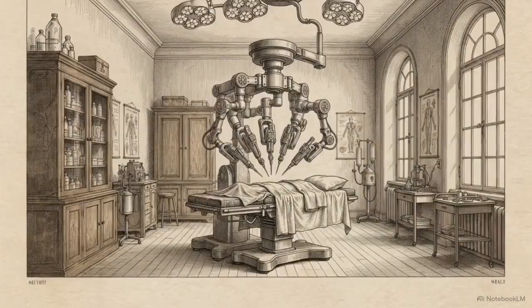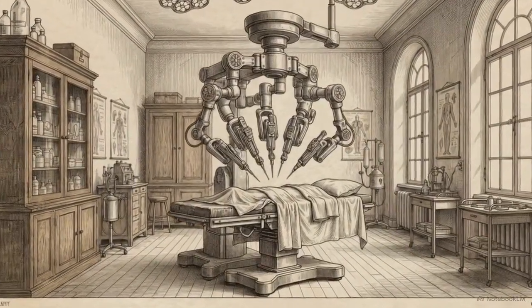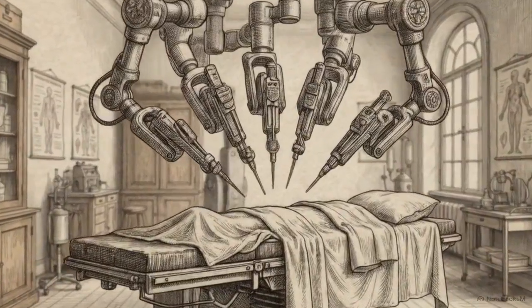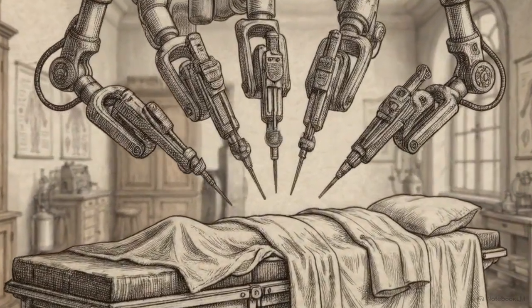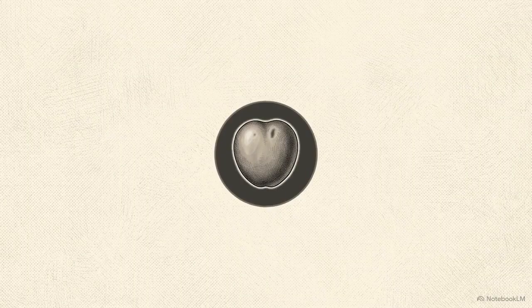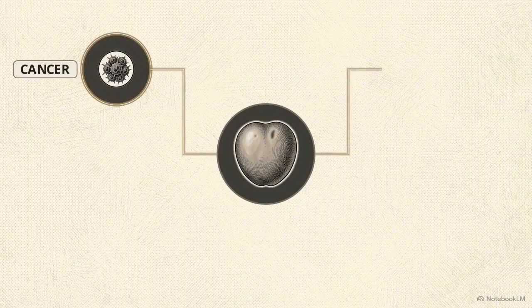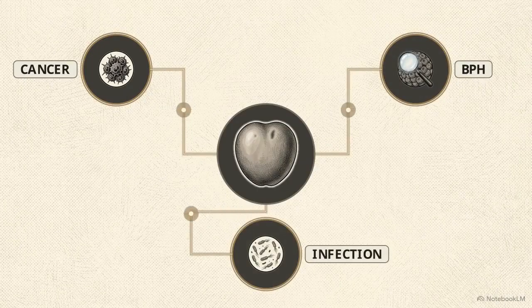Every measurement, margin, and zonal assignment on a scan dictates where a surgeon places a scalpel, fires a laser, or spares a nerve. Ultimately, matching the anatomical lexicon to the specific disease, cancer, BPH, or infection, transforms the MRI into a definitive surgical roadmap.